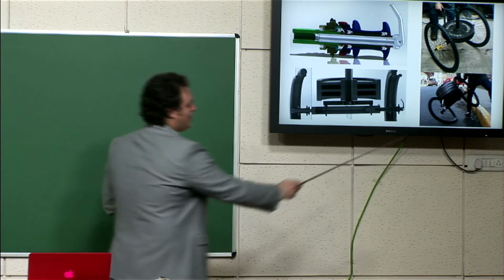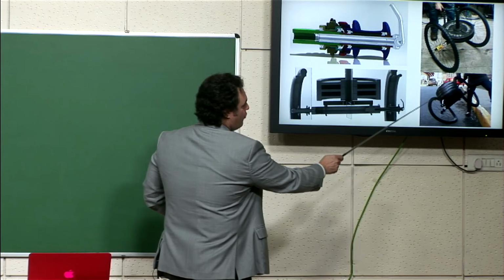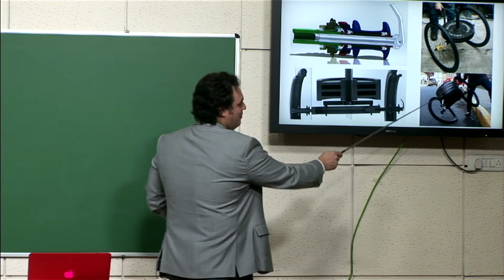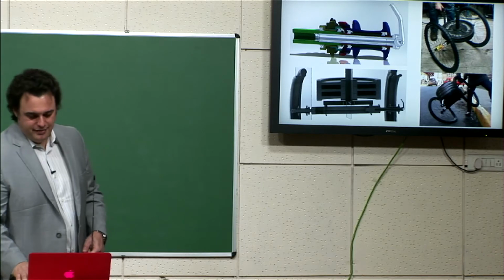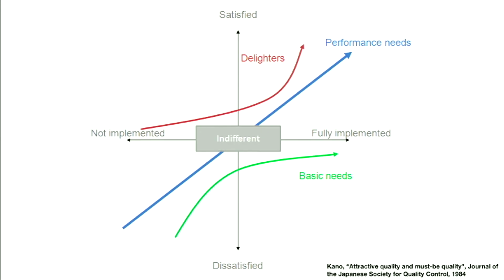So this is us, look at this, we're actually destroying this wheel here, because we have all these 45-pound weights, about 20-kilogram weights, stacked up. There's 4 or 5 of them, so a lot of weight in the chair, making sure our axles are robust enough. Now, another important point here from a design perspective I want to stress to you is this Kano diagram.